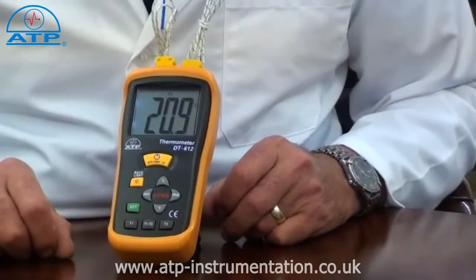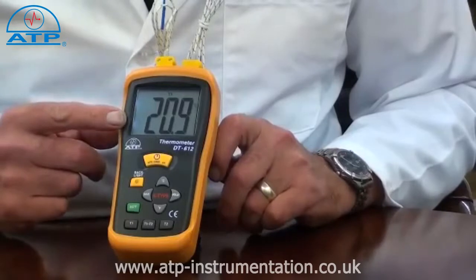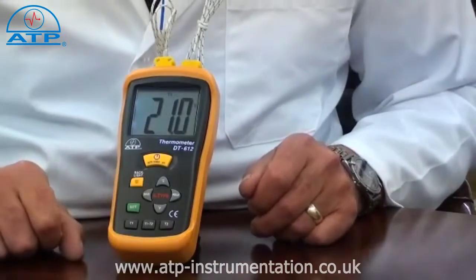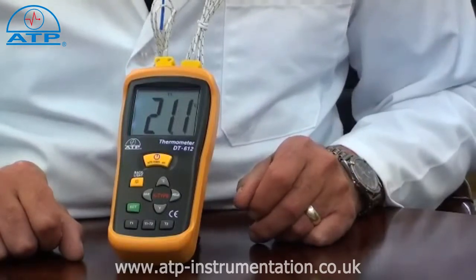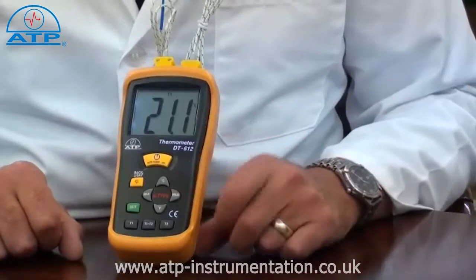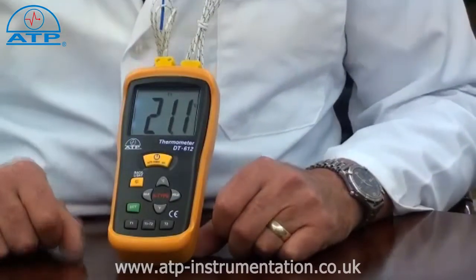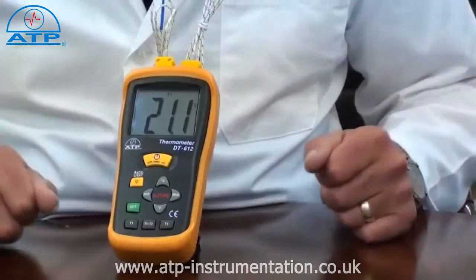The display is a large 45mm high contrast LCD with a backlight for applications in low light environments. The thermometer features a data hold function. When pressed, it will hold the displayed measured value even if the probes are removed from the sample.